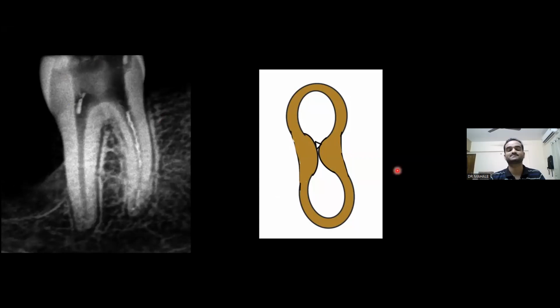In the first radiograph, it looked a bit like calcium hydroxide in the canal. But then when I irrigated again and visualized it under the microscope, I could see a file head in the mesiobuccal canal stuck in the isthmus of the canal. So now assessing the radiograph and clinical situation, it is a long H file extending from just below the orifice till the middle third. The whole file is extending above the curvature.